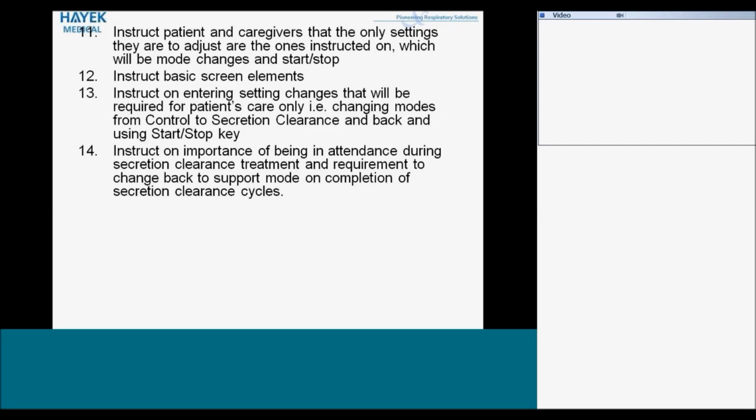And this is much more serious with patients that have no ability to care for themselves. So a neuromuscular patient that can't really do anything to clear their airway has to be suctioned for clearance. If a large plug that's been broken loose from deep in the lungs presents at the trach or up in the upper airway, then the patient needs somebody to be there to help them clear that out. So it's important that someone be there in attendance or very nearby while the patient's taking secretion clearance therapy.